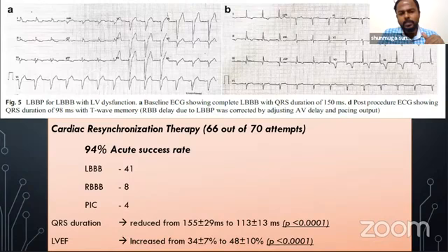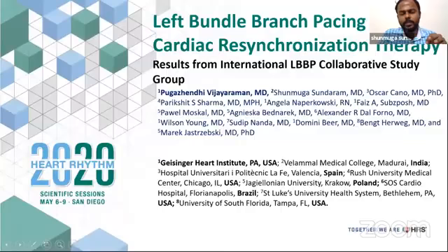As a replacement for cardiac resynchronization therapy, we have attempted close to 70 patients, and we could achieve a success of around 94%, out of which a classical non-ischemic LBBB constituted around 41. The QRS duration was reduced from 155 to 113, and LVEF improved from 34 to 48%.